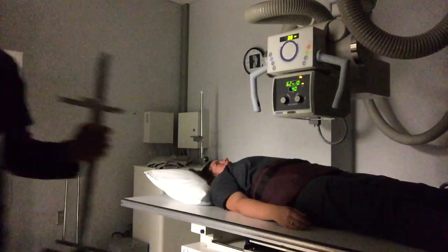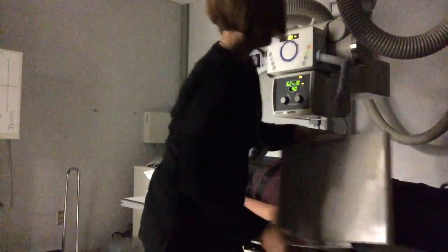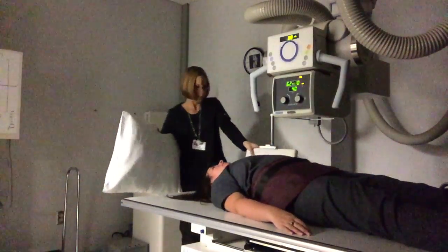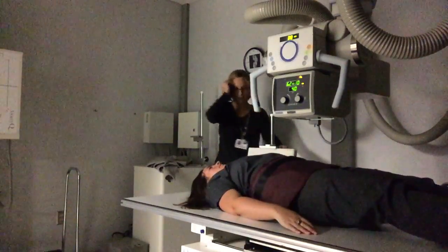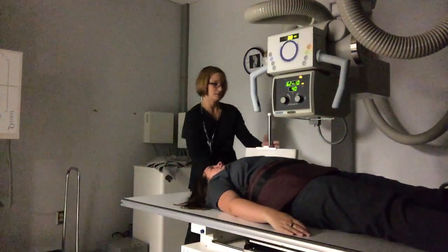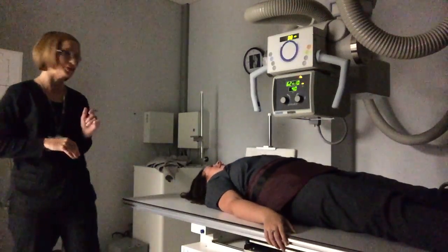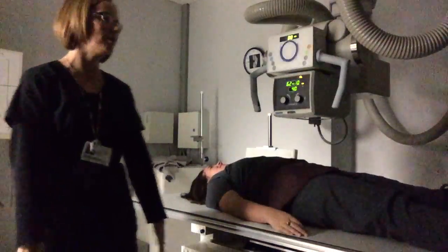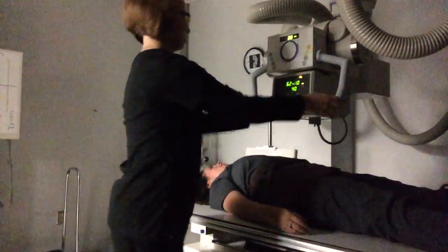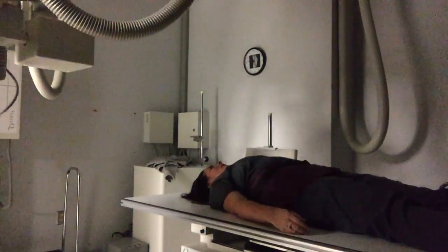Use the IR holder and bring it right next to the patient. Slide the IR right next to the patient — of course the shoulder is going to be in the way a little bit, which is mostly unavoidable. Have the patient try to depress their shoulders as much as possible. It's going to be difficult for the patient to do this if they're in a C-collar or have cervical pain, so just do the best you can. Move the tube so you're coming in at a 90 degree angle to the IR.